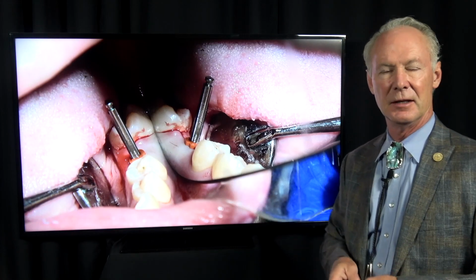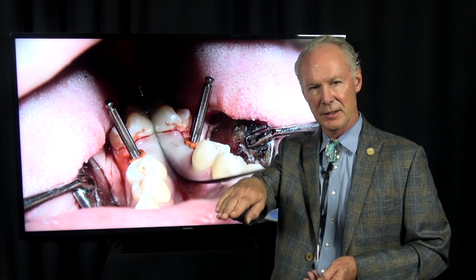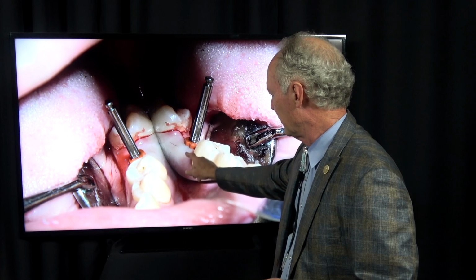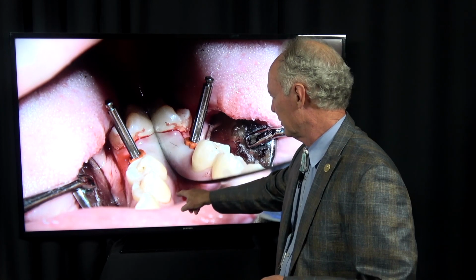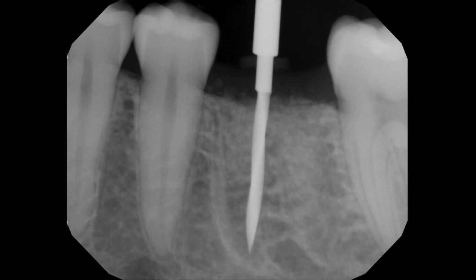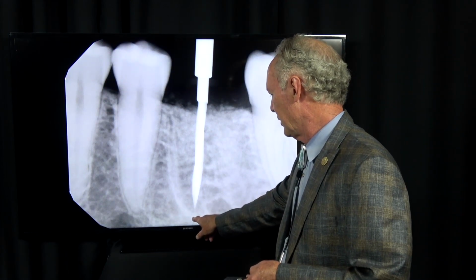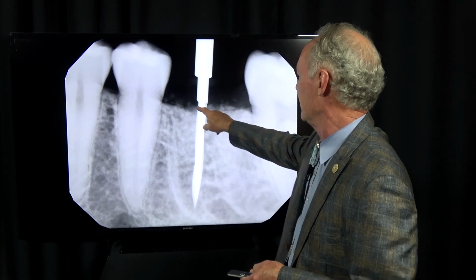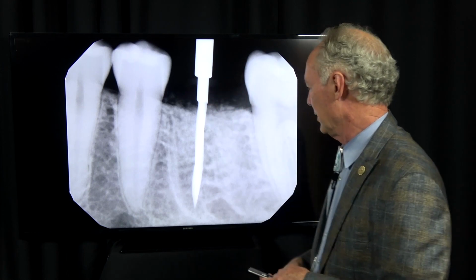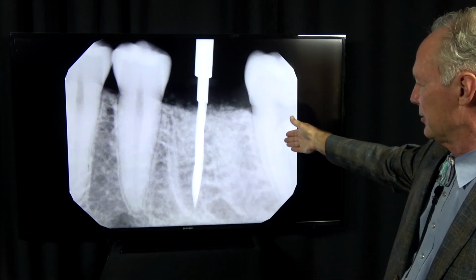You may be able to see the inferior alveolar nerve in the radiograph, but the tip of the root is going to be basically the inferior alveolar nerve. So if it's 15 from the bottom of the rubber stop to the tip of the implant, then you're going to be 13 millimeters in the bone, because we're giving 2 millimeters. See, here's the tip. We're still a good millimeter from the tip of the root, and so here's the alveolar crest, and the rubber stop is right here. So this is about 2 to 3 millimeters. And you can see my alignment is good. It's parallel approximately to the adjacent teeth.